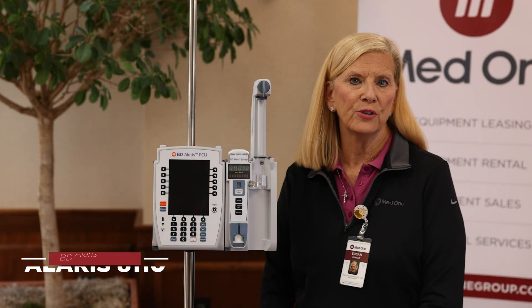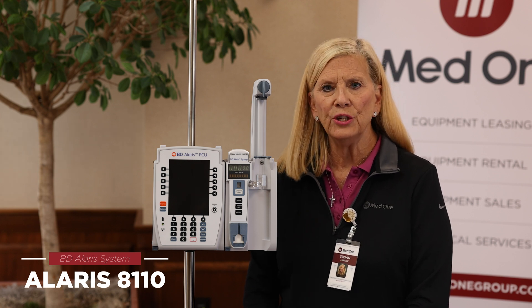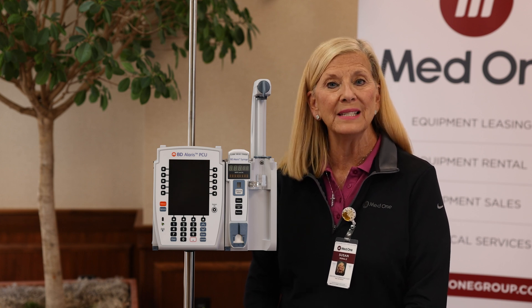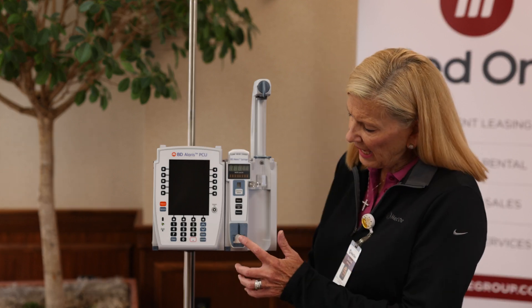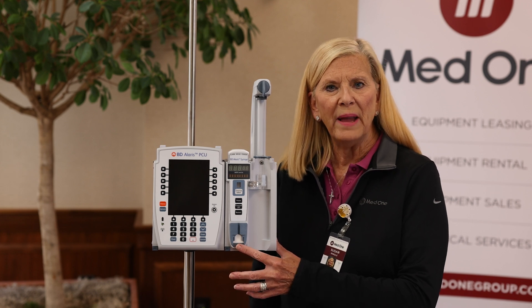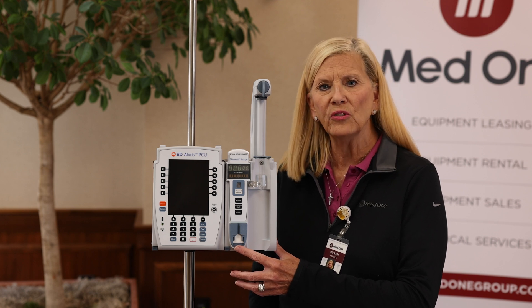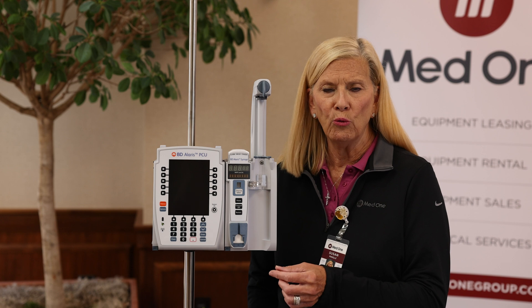This is the syringe module, model 8110. We typically see this used in pediatrics, neonatal settings, as well as anesthesia. It accepts up to a 60 ml syringe. It does have the capability of using what's proprietary called a pressure sensing disc, which more accurately monitors pressure in the line and helps cut down on mechanical slack for really small syringes and very low flow rates.